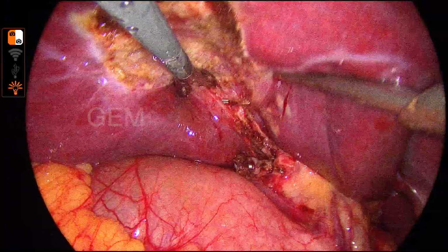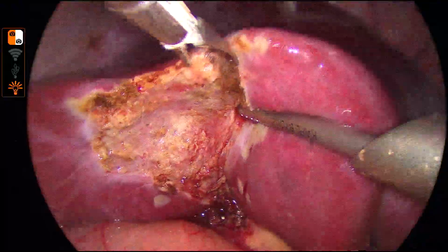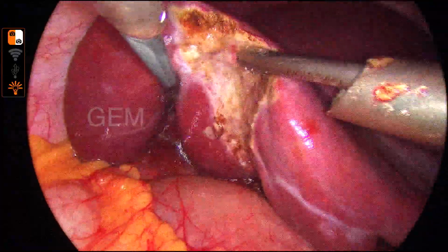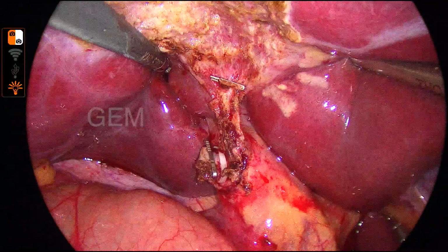So this video is completed now. Surgery is completed. This is the acute cholecystitis, total cholecystectomy. It is not a subtotal, it is a total cholecystectomy in grade 1 acute cholecystitis. This is the final inspection of the porta. Everything is fine. If everything is clean, there is no need for a drain.